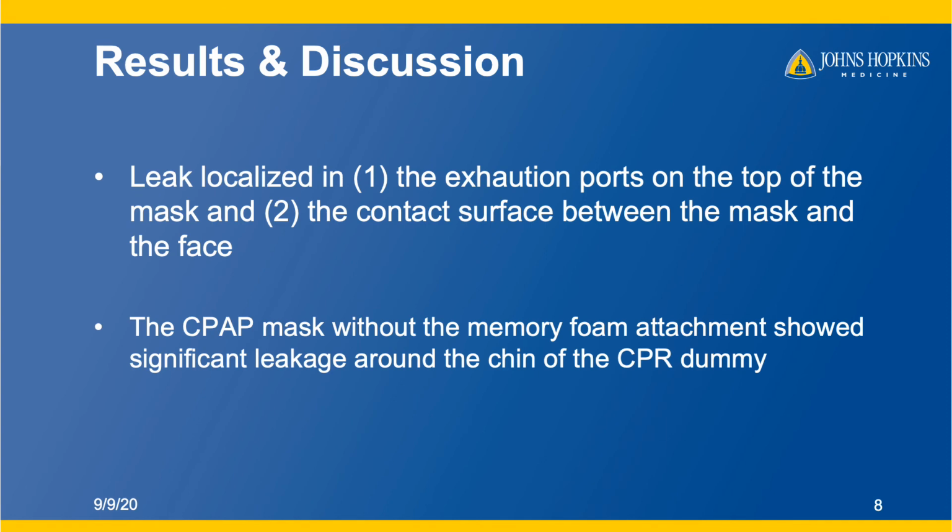Using our proposed experimental setups, we first confirmed that the majority of the aerosol leakage is localized in, first, the exhaust ports on top of the mask, and second, the contact surface between the mask and the face. To compare the leakage performance between the control mask, without any memory foam, and our prototype mask with the memory foam, the CPAP mask without the memory foam attachment showed significantly more leakage around the chin area on the CPR dummy, which I will show in the next slide.